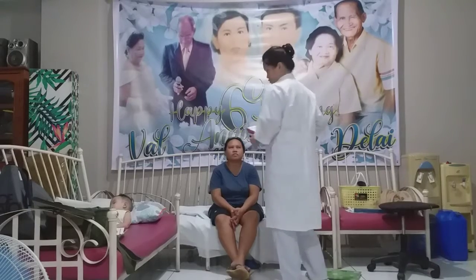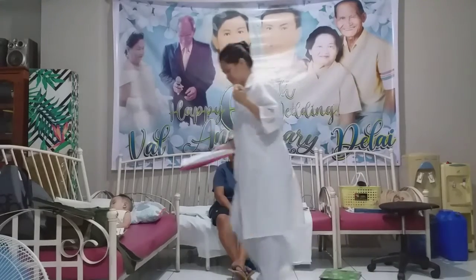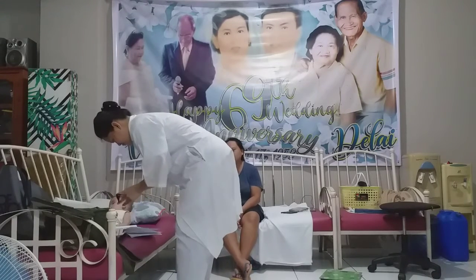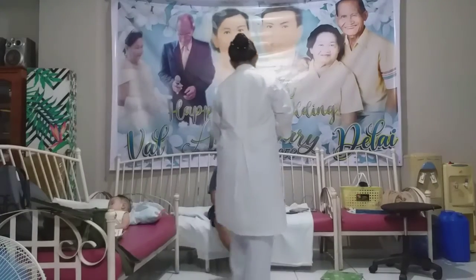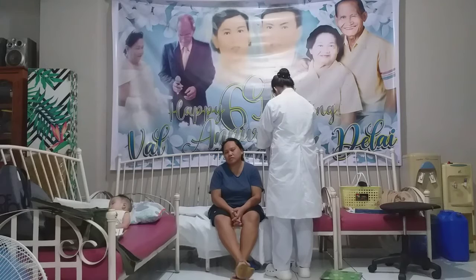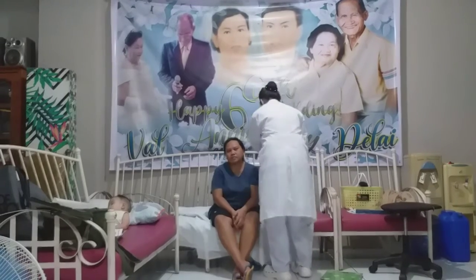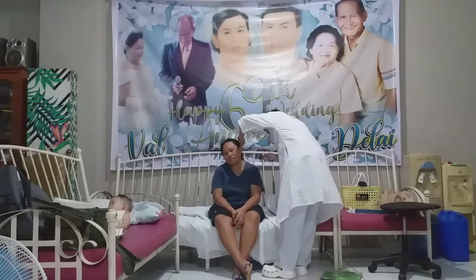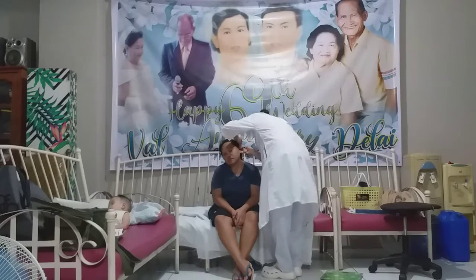The next thing to do is use an otoscope to inspect the external ear canal and the tympanic membrane. So ma'am, let me check your ears using this otoscope. Is it okay for you? Okay, ma'am. Please just stay still, and it will be just fast and not too painful. And while inspecting her ears, you should pull the ear up like that. And on the other side.